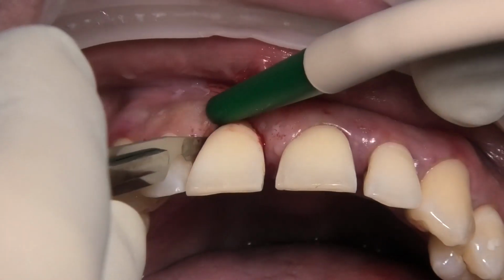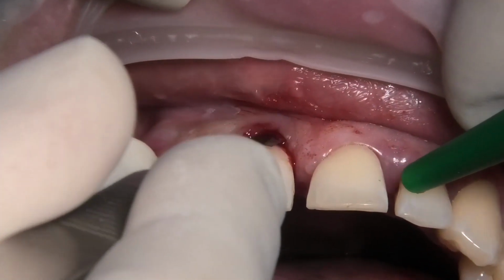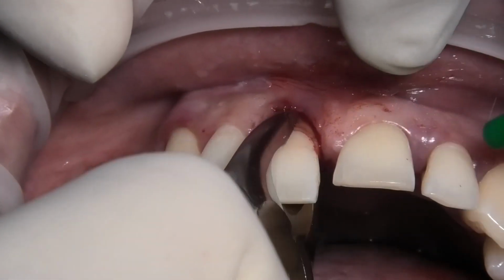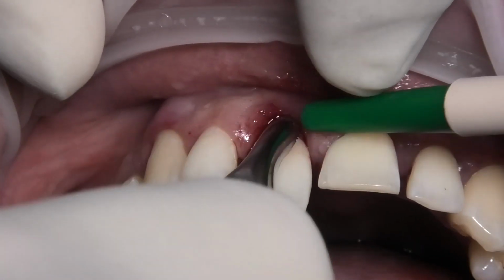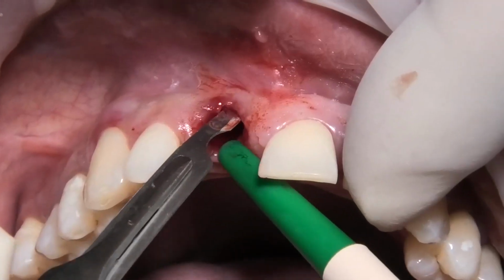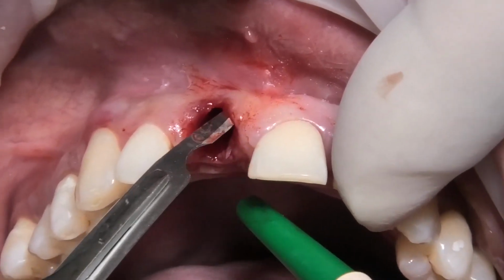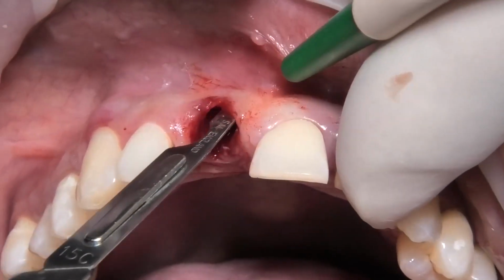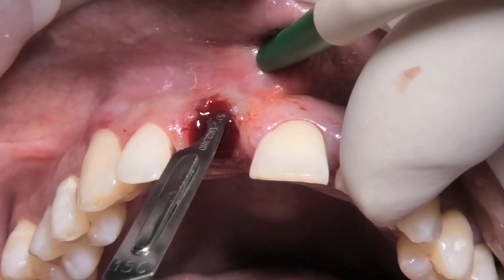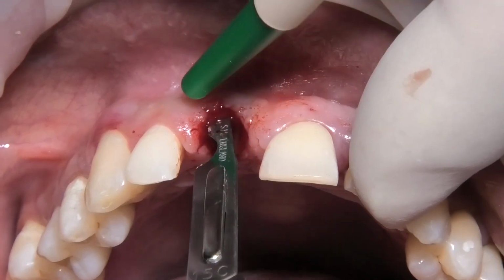This involves a periotomy with the scalpel, the extraction of 1.1, and the removal of circumferential epithelial tissue. The movement to extract is circumferential, no vestibular or palatal, and then with the scalpel we create a partial thickness envelope with a vestibular incision with the scalpel blade 15C.